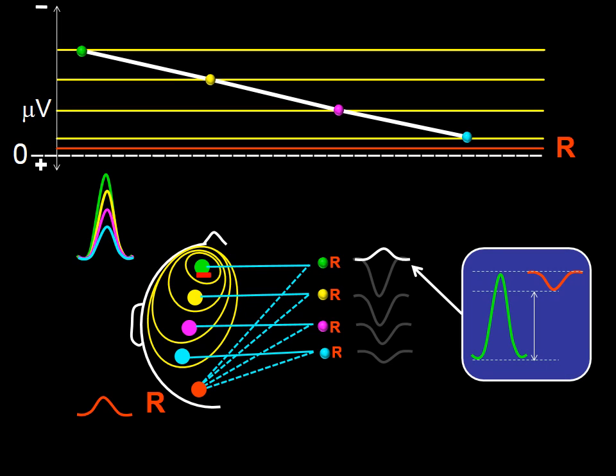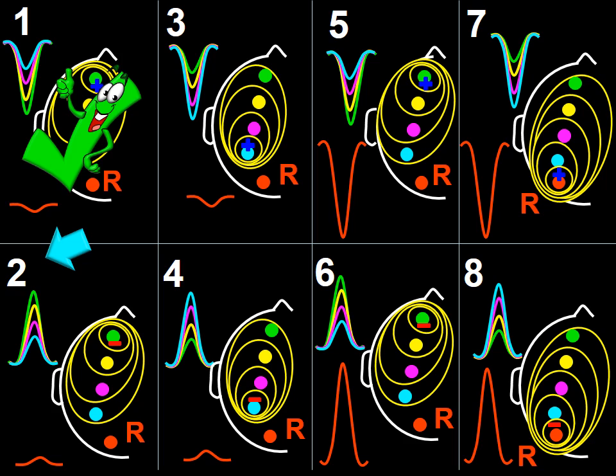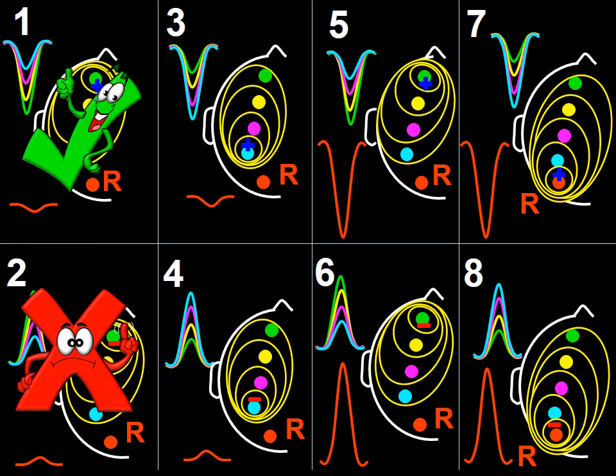As you can see in this frame, I have omitted many steps and just shown you that the first wave produced by the mechanism we previously detailed will correspond to what you are seeing in this frame. The bottom line is that the wave produced by such a configuration is in the opposite direction than the wave in question. So option 2 is not a sound option.